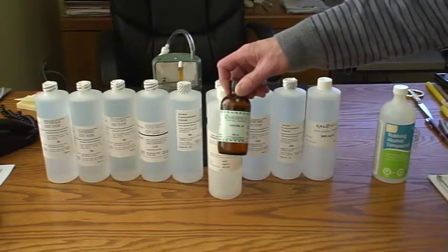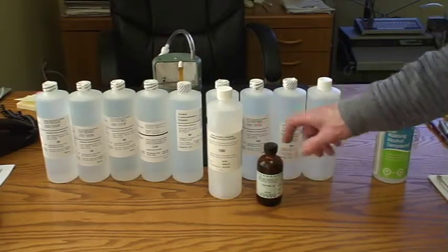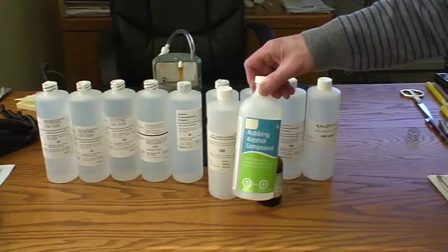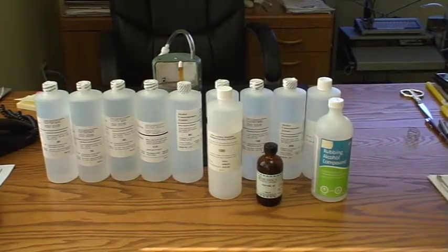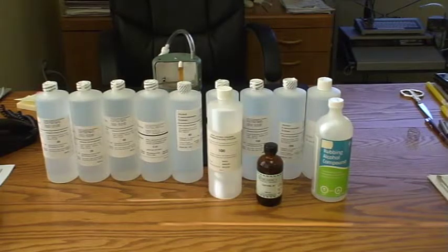Sometimes I'll add a drop of acetone into a simulator together with ethanol. Or as well, I could try an experiment with isopropanol as an interferent. But there's no reason why you couldn't have acetone in distilled water as a test standard in a simulator, or isopropanol in distilled water as a standard.